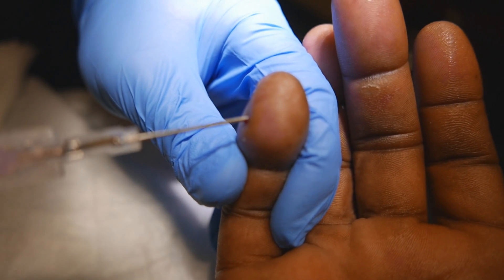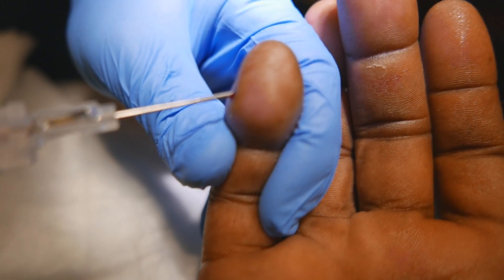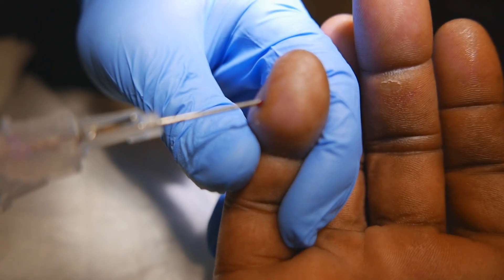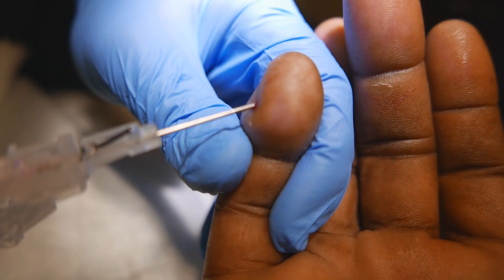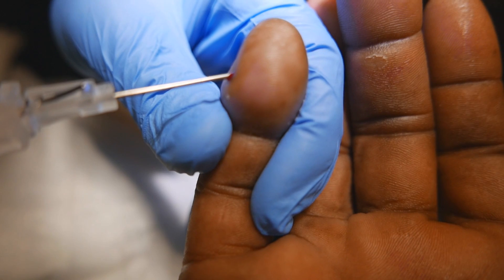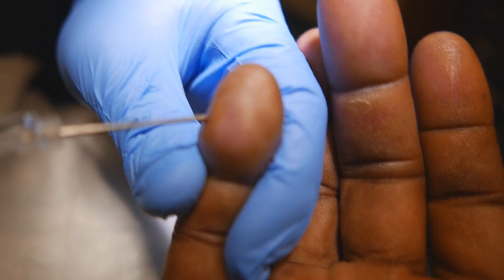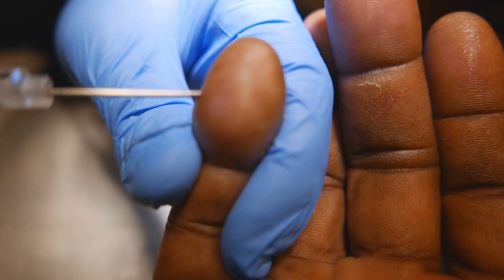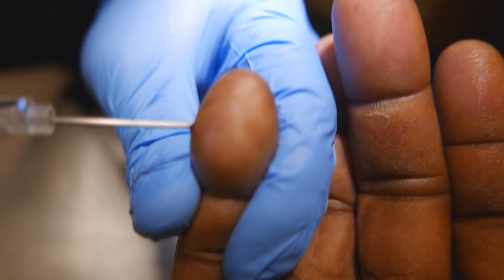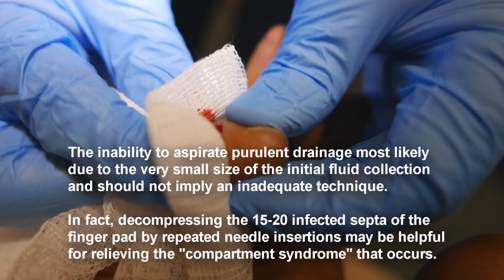There's bone right there. Not really getting a whole lot. You getting anything? No — but do you feel like you're in the right place? Based on your anatomy, bone right there, yeah, it's right on top. Okay, good enough. Now that you've got an opening there, see if you can actually express pus.